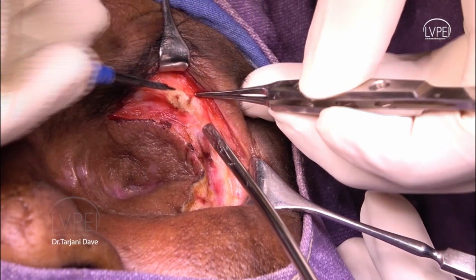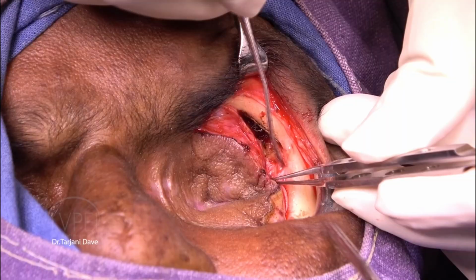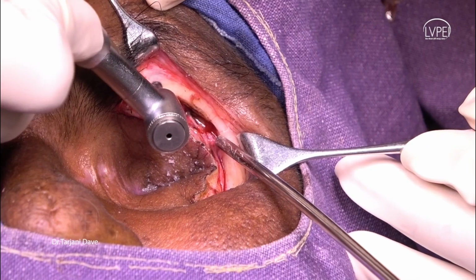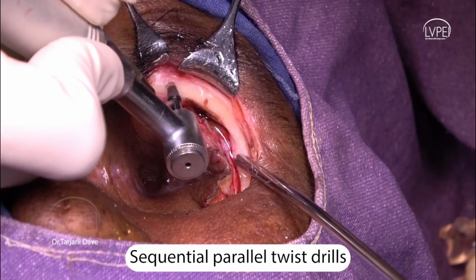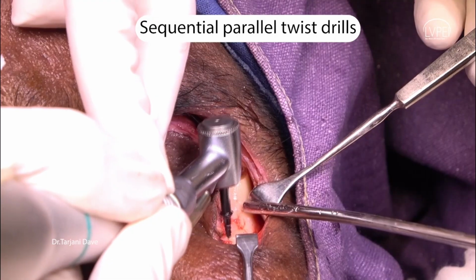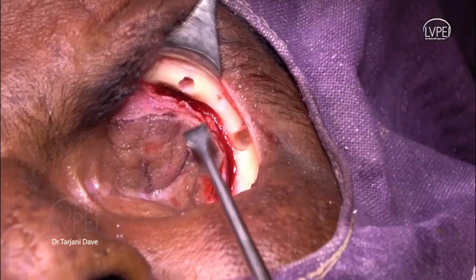Now, the periosteum is lifted away from the bone with the help of the sharp end of a periosteal elevator. Bone template is placed on the bone to help orient the direction of drilling. Pilot holes are drilled followed by sequential parallel twist drills in order to widen and deepen the osteotomy hole to the required size. Bone drilling is done perpendicular to the bone as it will affect the trajectory of the implant. Also, copious irrigation is given during drilling to avoid thermal bone injury that can affect the osseointegration process.